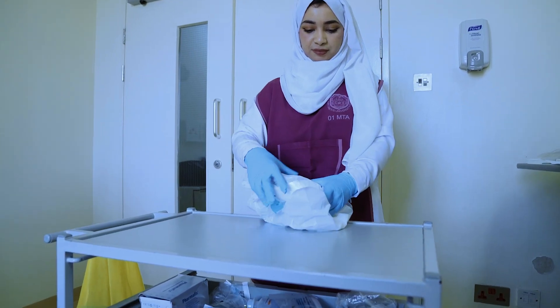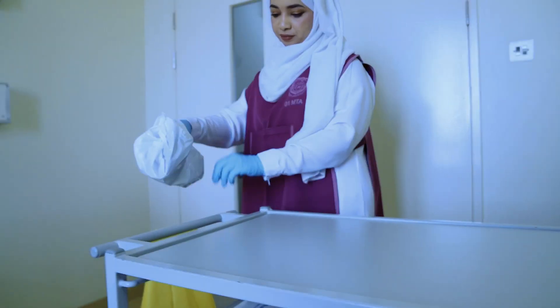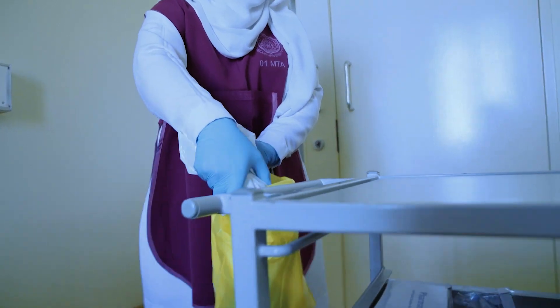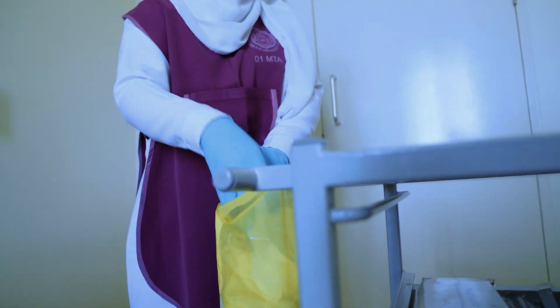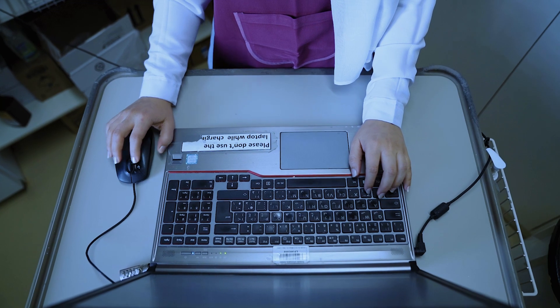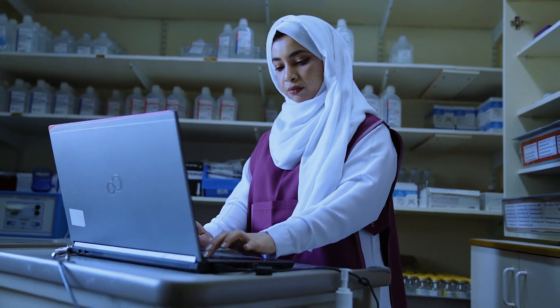Discard used materials and gloves as per biohazard waste disposal policy. Perform hand hygiene after the procedure. Document the procedure in the electronic patient record.